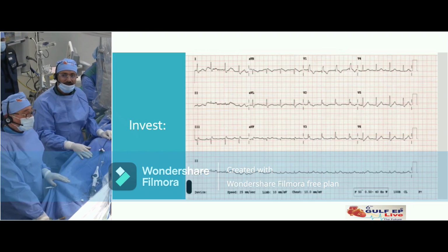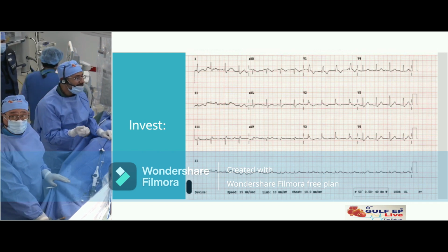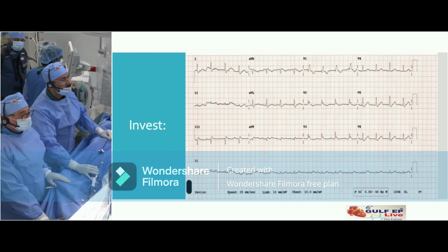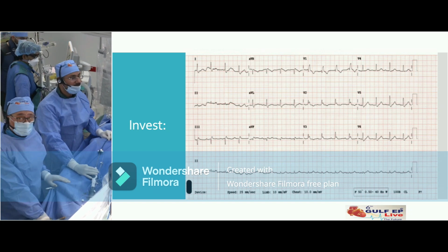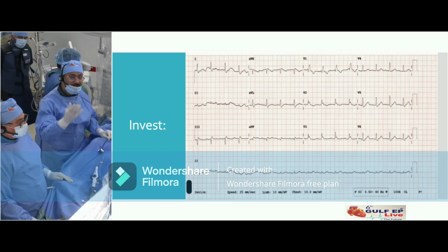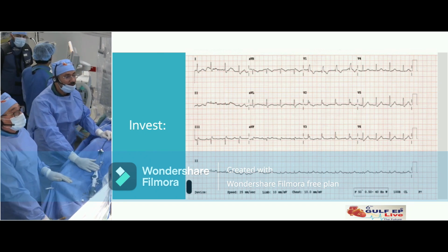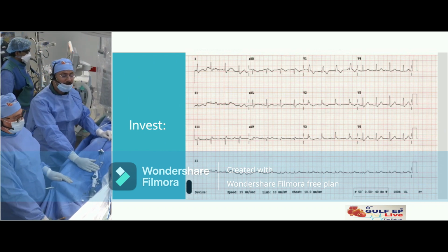Next slide, please. And this was the ECG. Any comment from your side? When you look at this ECG in an 86-year-old complaining of syncope, I think you get worried. Do you agree with me? From the panel, the audience, yeah, exactly. You have a clear, almost trifascicular block in an 86-year-old coming to the ER with syncope. So that's why the patient was monitored.